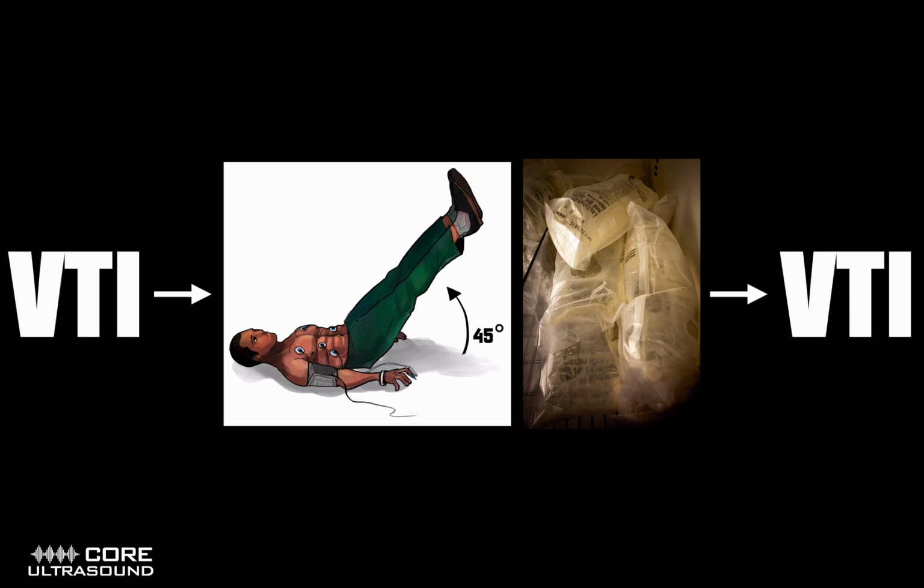And just to clarify, the passive leg raise, you should start with your patient with their torso actually up at about 45 degrees, do your VTI, lay them down flat, and then lift up their legs to 45 degrees and then recheck it at that point.